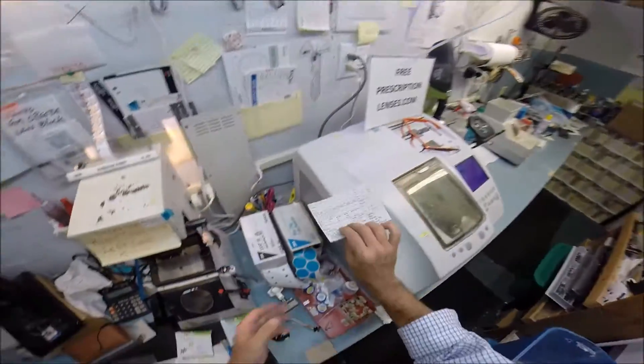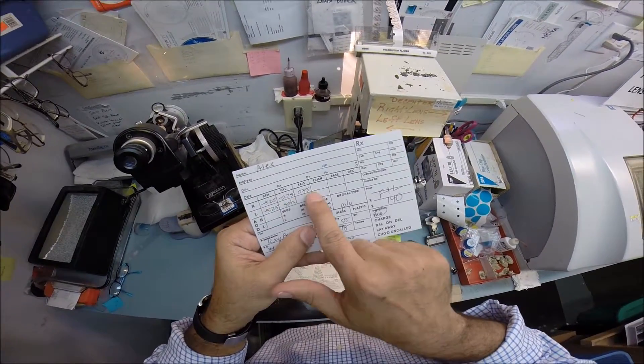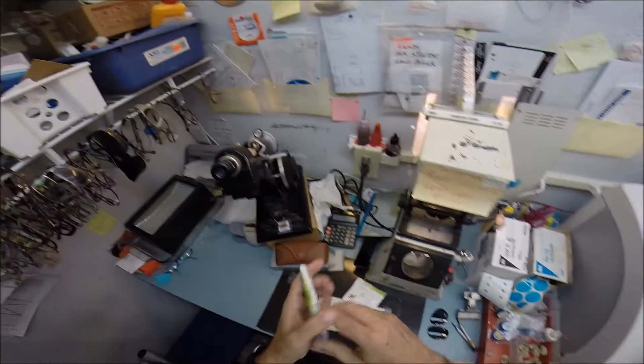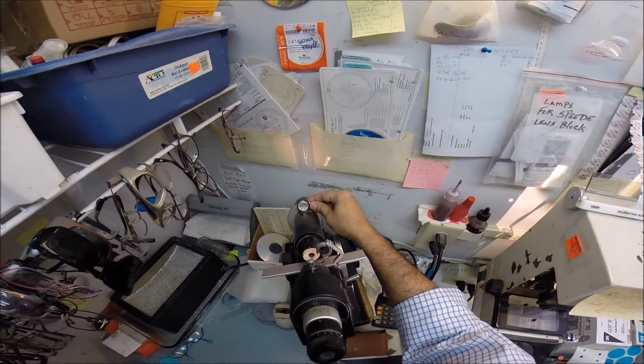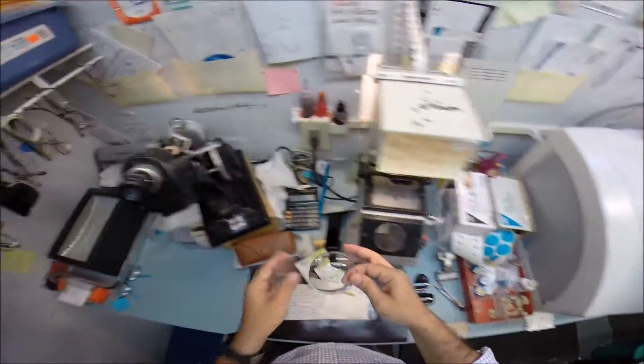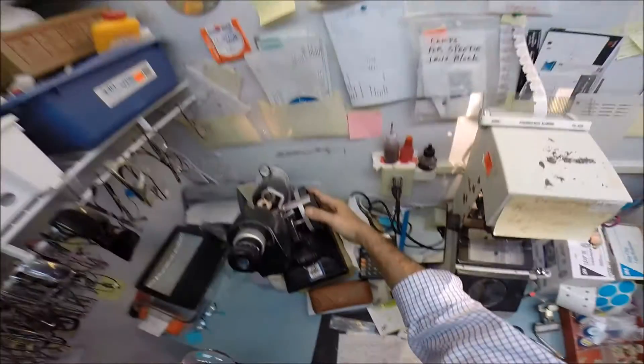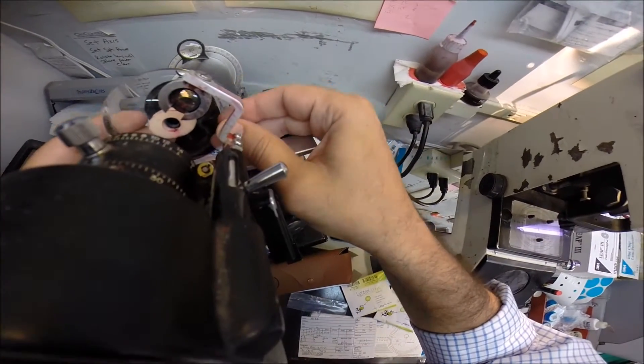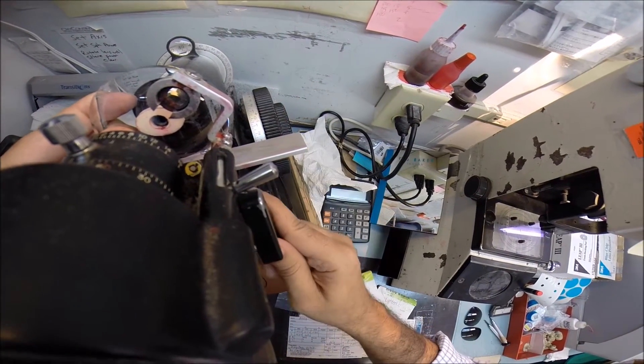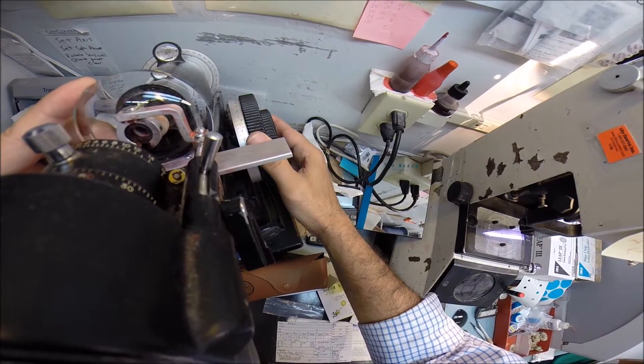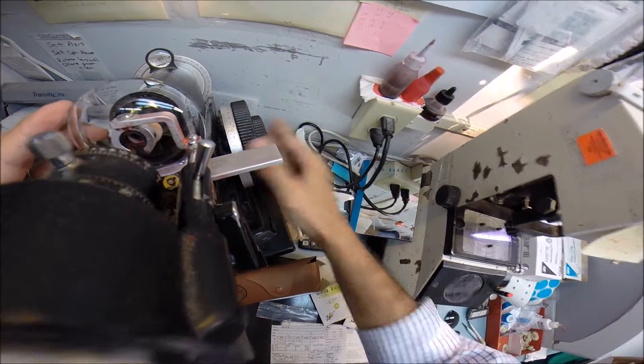I'm going to get your right lens. I need your paperwork again, which reads minus 5.25, minus 75 at 35. I'm going to spin the axis wheel of my Marco 101 lensometer to 35. Take your lens out. I'm going to put the power drum on minus 5.25. Put your lens in there. Rotate until the sphere power comes in clearly. Find the optical center. I'm going to check your astigmatism correction.